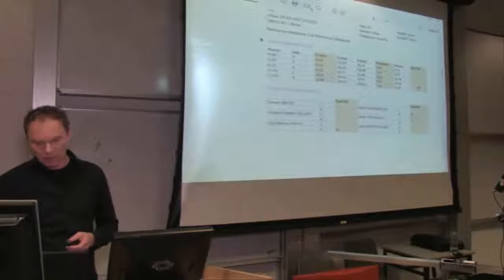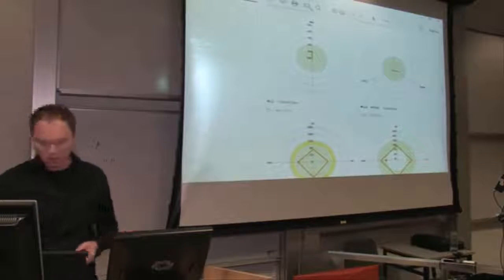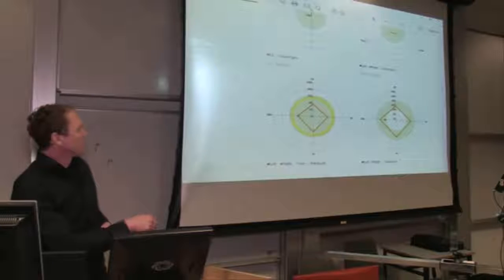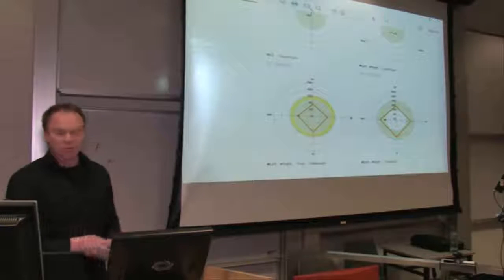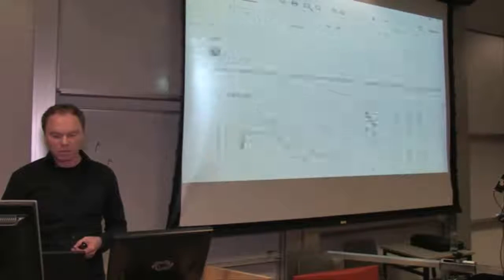Let's look at this point of view. Of course, if you have just a few muscles, you don't see much. What you see here is that all four muscles that were measured are faster than the average, and all displacements are within the normal range. So when comparing to the reference values, his values are almost optimal.